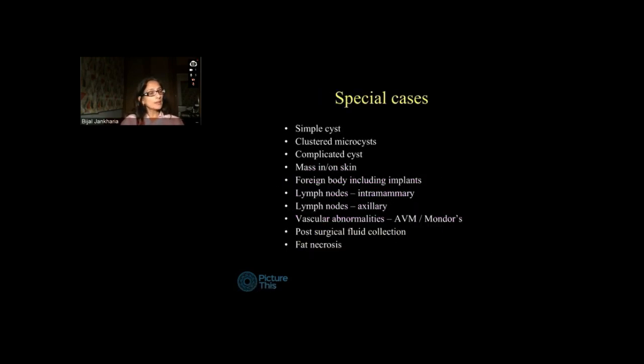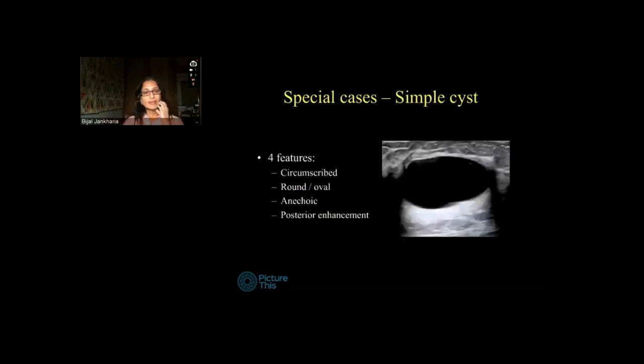Then we go on to certain special cases. A simple cyst is like a nice anechoic lesion, good posterior enhancement, thin imperceptible borders, and edge shadowing.